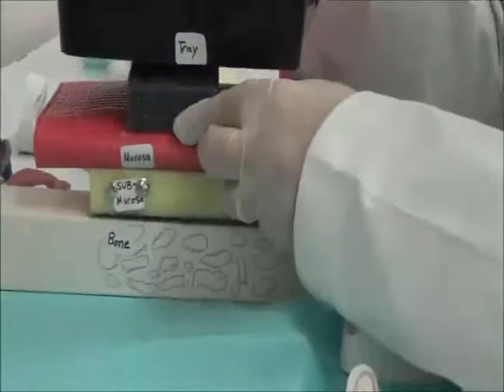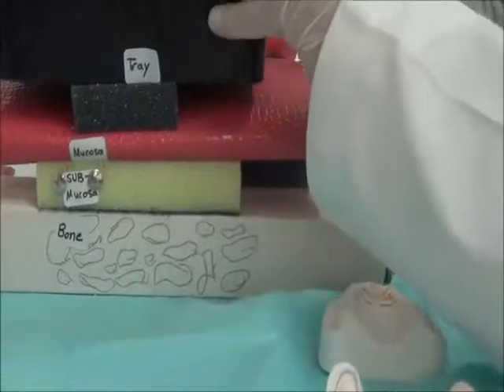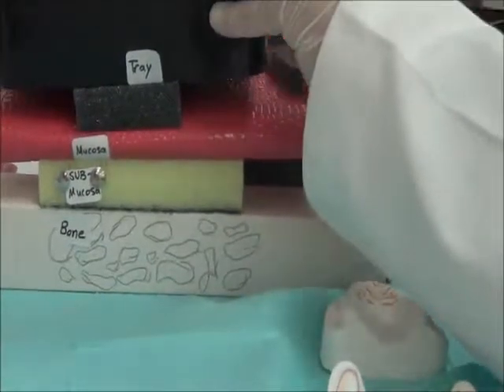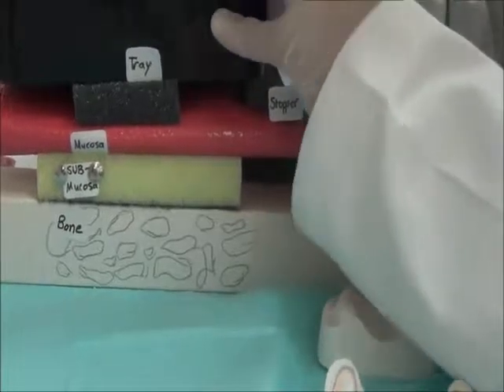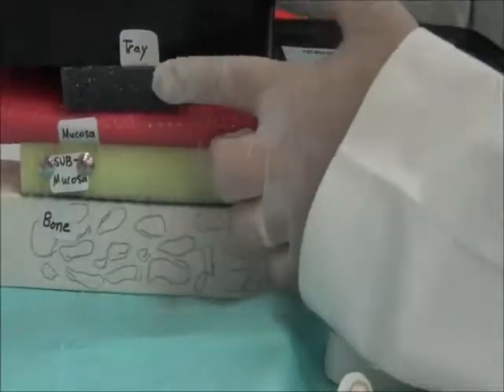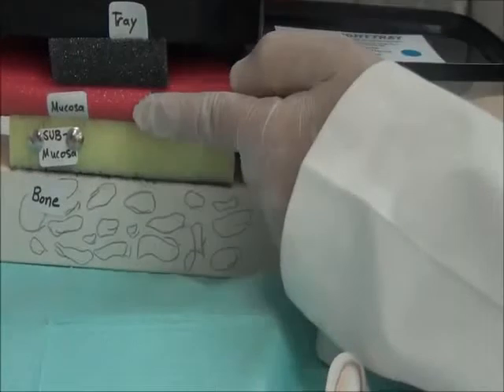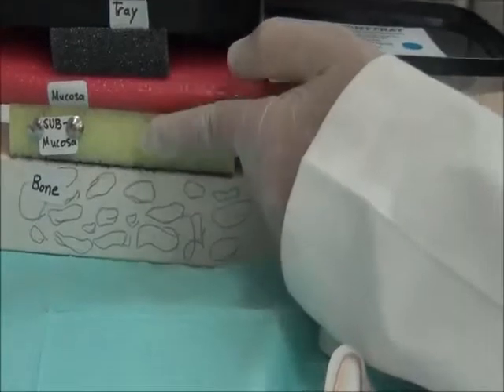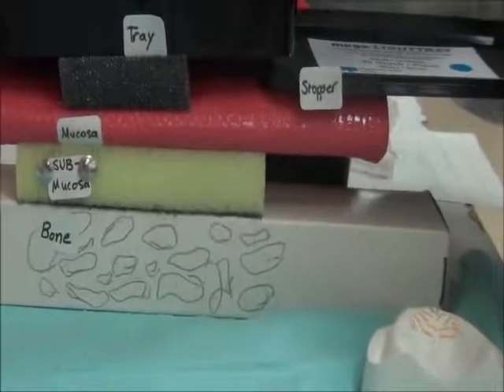With the spacer preserving the space for impression material, we could not squeeze a lot, because we also have stoppers maintaining this space. So no matter how much I squeeze, the impression material stays not in a totally compressed status. This is called the mucostatic. Notice that the mucosa, submucosa are not in a compressed status as they were in tissue compressive technique.